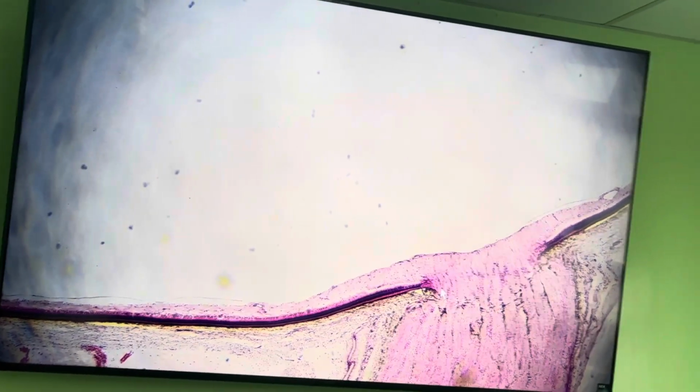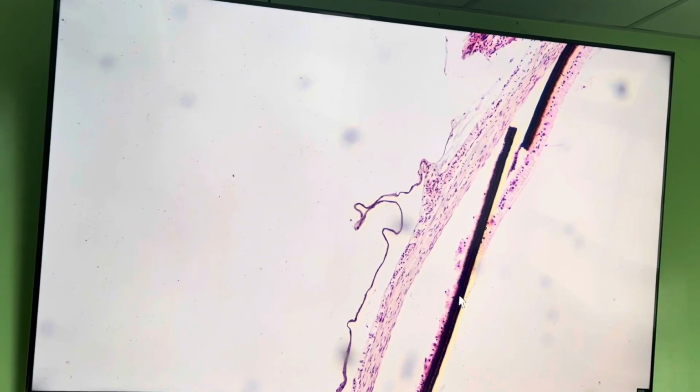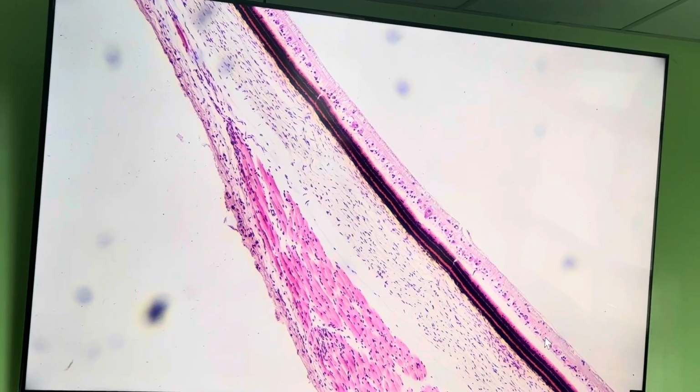And then we go to the choroid, which would be continuous up to the area of the optic nerve. We can see that in this particular area we do not have the choroid. So the choroid would be the source of blood for the retina. It would serve to support the retina. And you can see here the choroid, and this would be the retina.